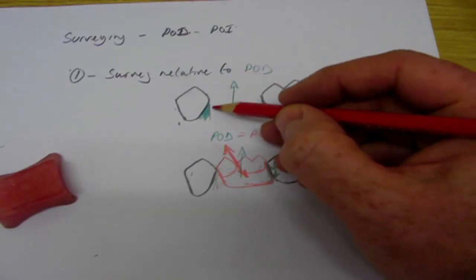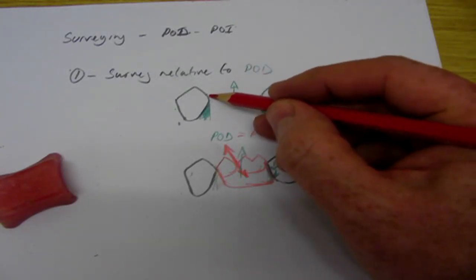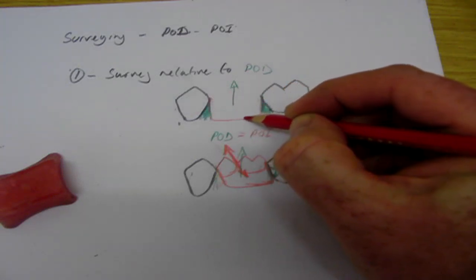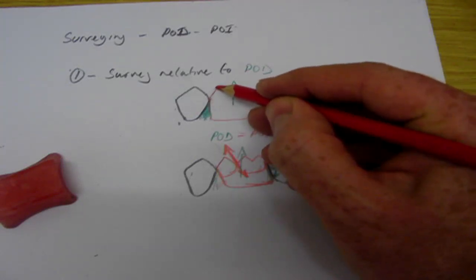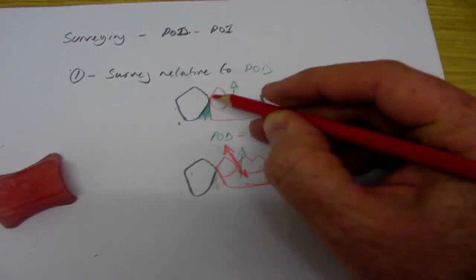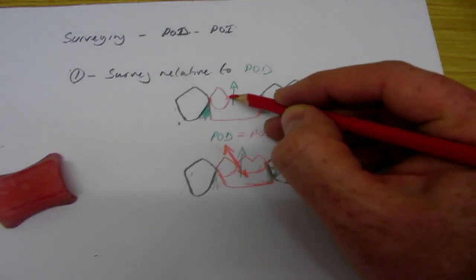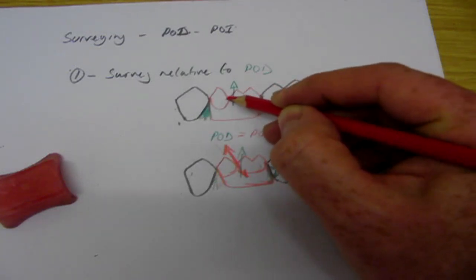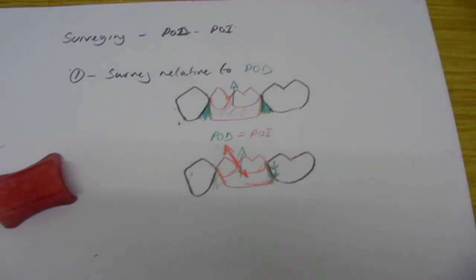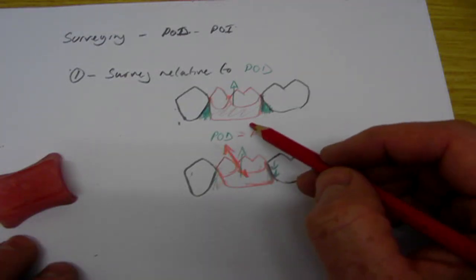Of course, when we had our situation here where we've got the path of displacement and we've just blocked out the undercut, our denture would fit like so, and it would just contact the contact points here and here, and there'd be gaps either side of the saddle area. So the teeth would go on something like this, wouldn't they? Yeah. So this is with the bounded saddle.